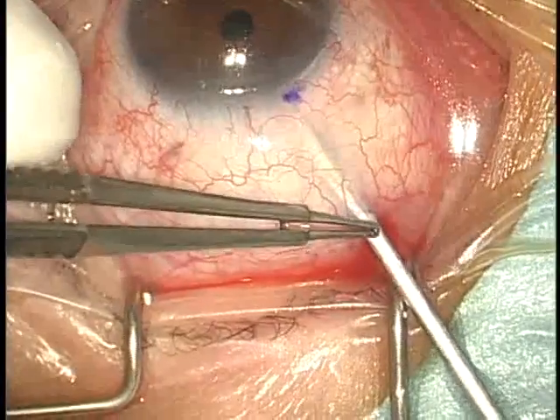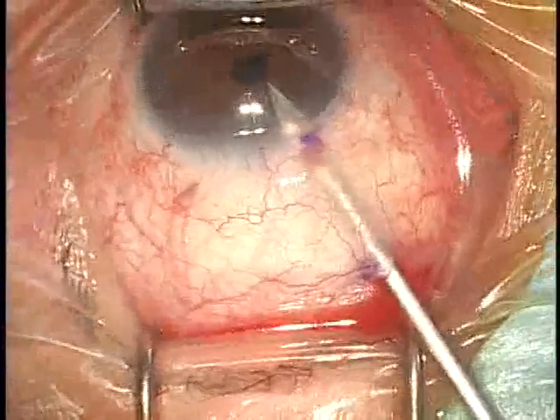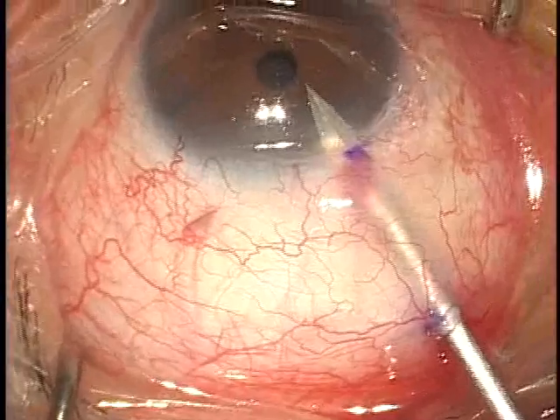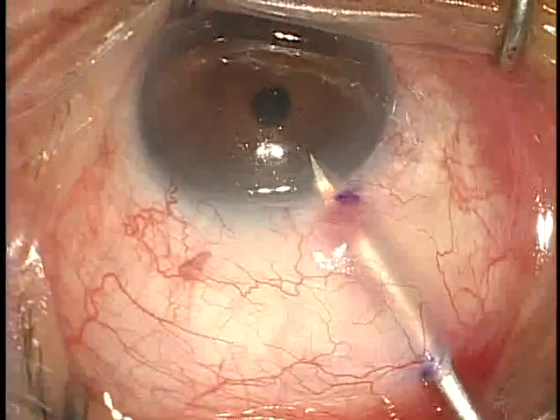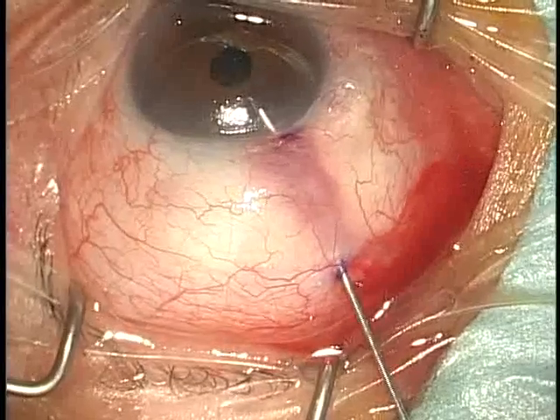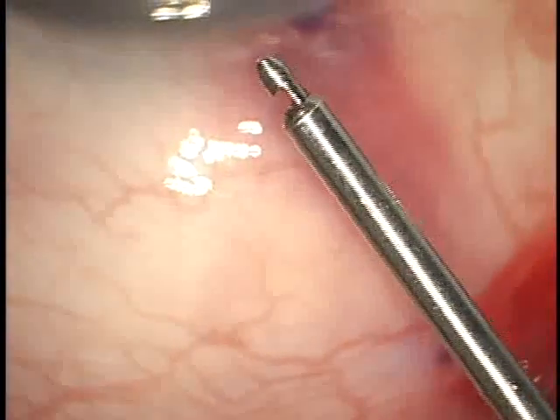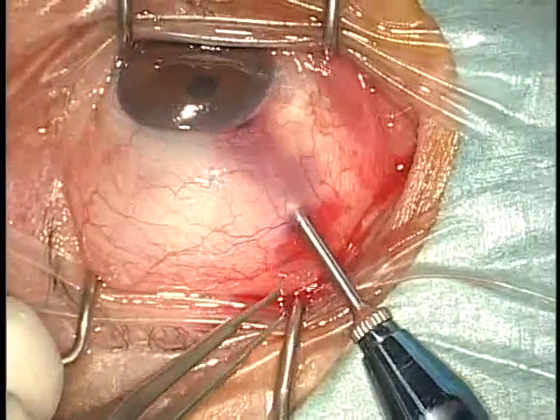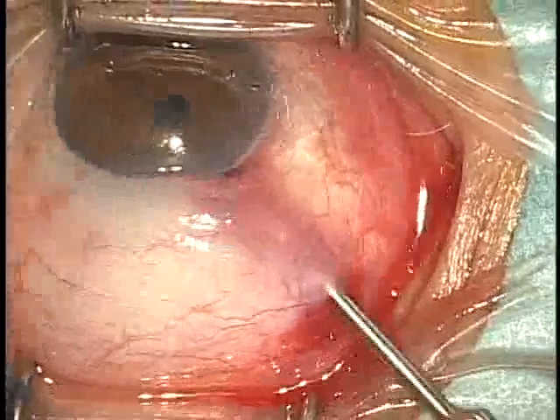A 19-gauge V-lance knife makes the oblique scleral tunnel into the anterior chamber through the 1mm conjunctival incision. Our minimal incision technique is designed to be a less traumatic procedure compared to standard trabeculectomy or sclerostomy. The incision is very small, and we inject mitomycin C into the subconjunctival space directly without damaging the corneal epithelium, resulting in very little scarring that could cause failure of glaucoma filtration surgery. After injection of viscoelastic, the Fukasaku Micro Punch performs trabeculectomy through the 1mm conjunctival and Tenon's capsule incision with 2 or 3 bites.